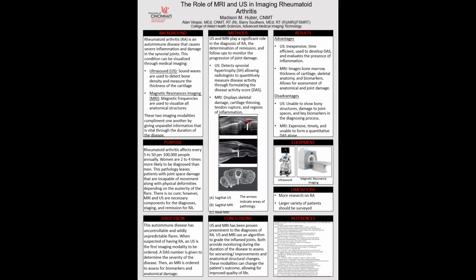However, MRI and ultrasound are both necessary components in the diagnosis, staging, remission, and treatment of rheumatoid arthritis. It is important to note that this autoimmune disease has uncontrollable and wildly unpredictable flares. When a patient is presenting symptoms suspicious of rheumatoid arthritis, an ultrasound will be the first imaging modality to be ordered.